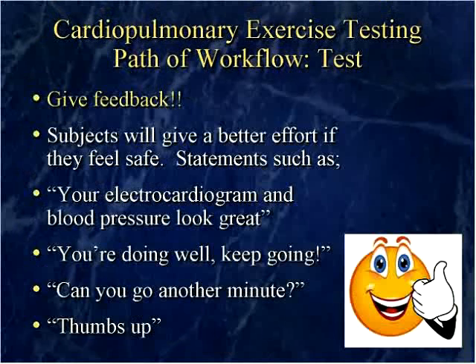And just make sure you give them feedback during the test. I'll tell you, a patient will go a lot further if they feel safe. Statements such as, your electrocardiogram and blood pressure look great. You're doing well. Keep going. You can go another minute, right? Thumbs up. Just encourage them, and you'll get a much better VO2 max and quality of data if you do this type of encouragement during the test itself.